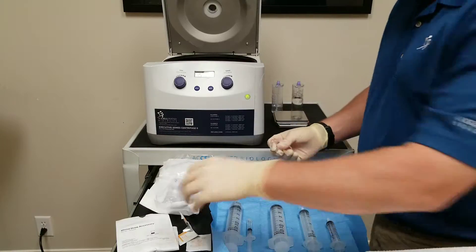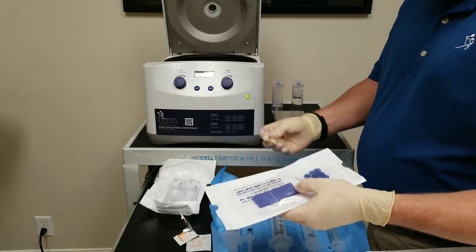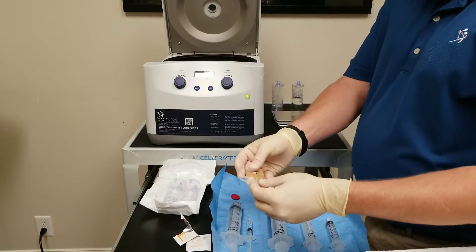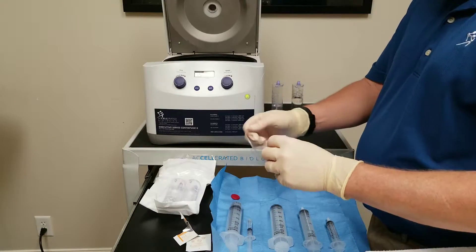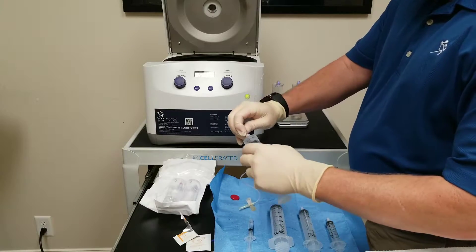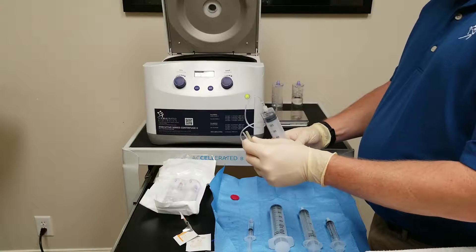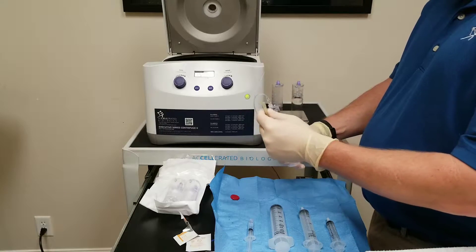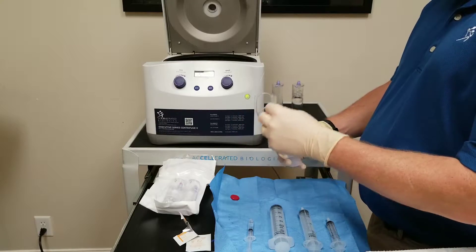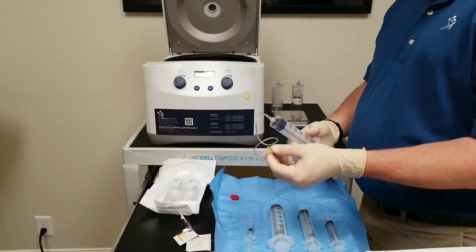Use our blood draw accessory which will have your tourniquet, band-aid, gauze, your necessary alcohol swabs, and a 19 gauge butterfly needle. Attach the butterfly needle to our 60 ml syringe, and I just like to prime it so I can have all the anticoagulant — I can see it go all the way through the tube and it just pops up the tip. So at this point we would now be ready to draw blood from the patient.